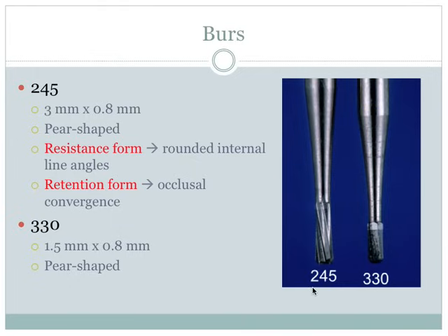So usually for soft tissue surgeries, you're going to pick a diamond over a carbide burr because the blades will likely pull on soft tissue and cause more bleeding, whereas a diamond abrades and cauterizes and doesn't cause as much bleeding. But there are different uses for each kind of instrument.